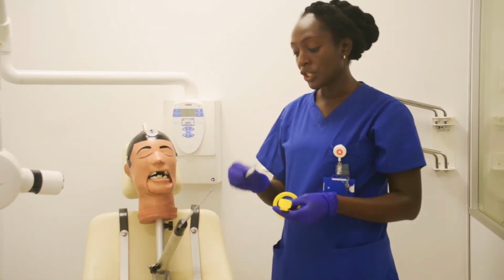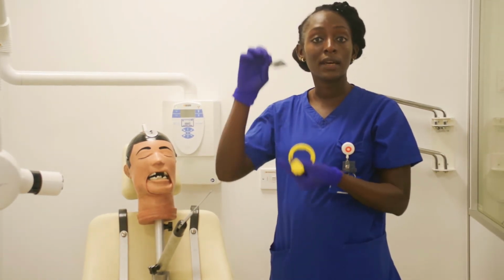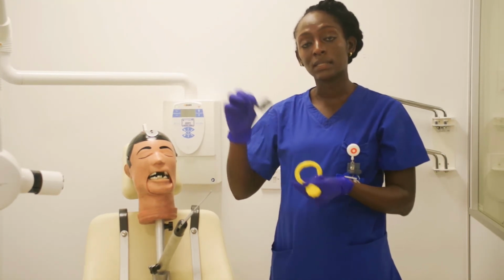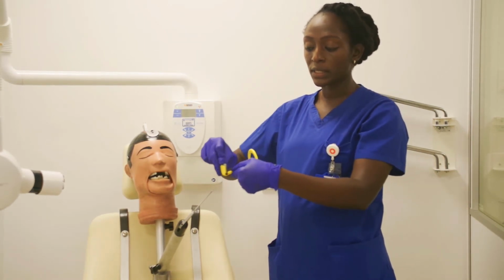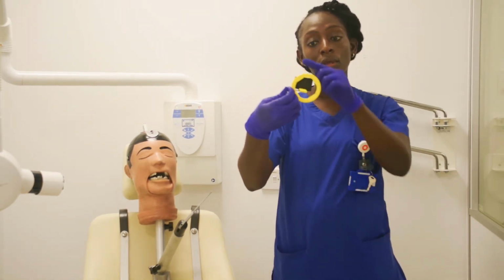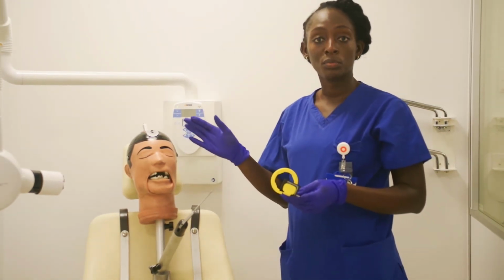And as Mark mentioned, we've already pre-assembled our phosphor plate. The back is towards the clear side and the phosphor layer is covered because it would be sensitive to light once the x-ray has been taken. So we want to place the phosphor plate in the slot, making sure that you can see the phosphor plate through the ring.